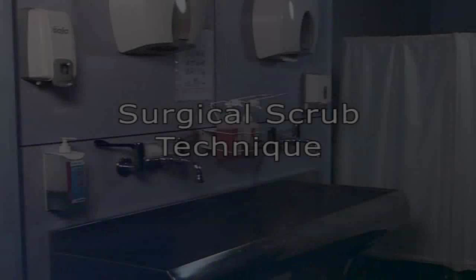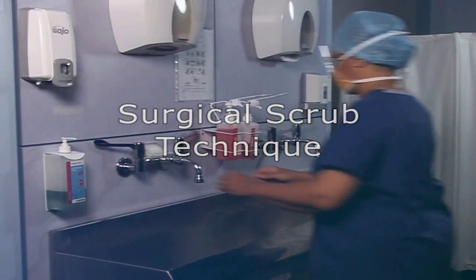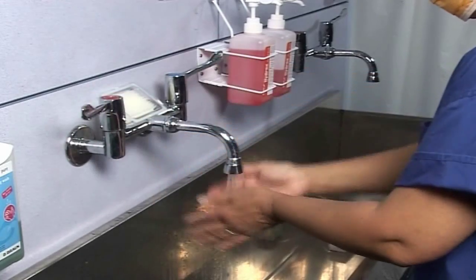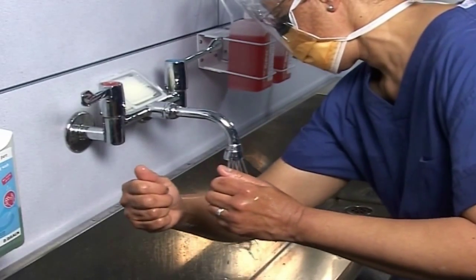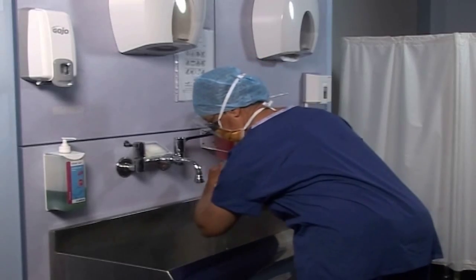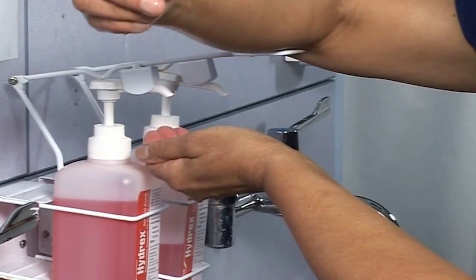Before getting scrubbed you need to ensure that you have your gown packet open, having made sure that there are no tears in the wrapper or the seal and the sterility expiry date is not expired. Turn the water on so that you end up running it at the correct temperature for you, having ensured that you are wearing the correct theatre attire and personal protection in the form of a face mask with visor according to the hospital's trust.